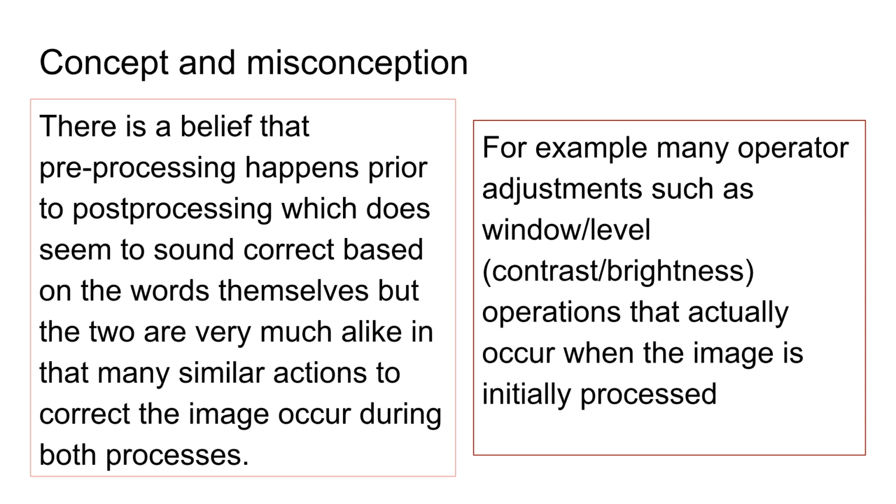There's some language that you may see, things like pre-processing versus post-processing. And really, I just want you to understand that there's really only one process.